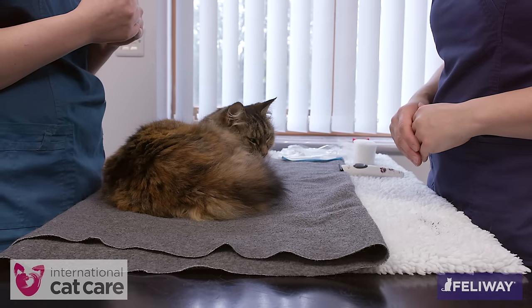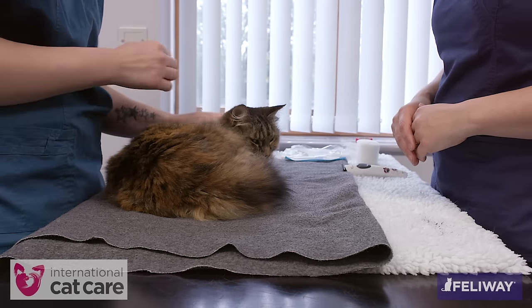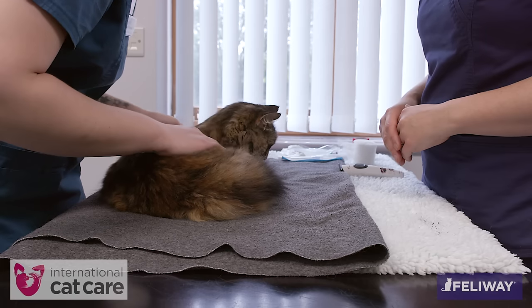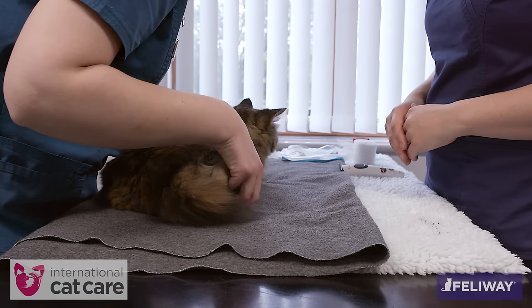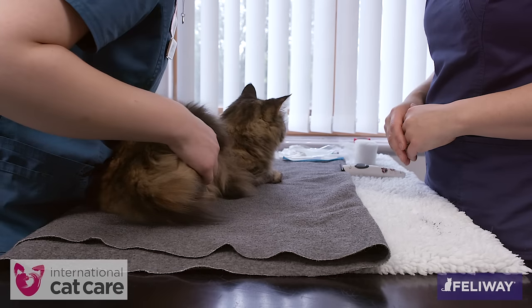To hold a cat that needs an intravenous catheter, the fundamental principles of cat-friendly handling should be applied. Place a towel on the table so it is warm and not slippery for the cat. Move slowly and calmly and reassure the cat by talking and stroking it. Before starting to restrain a cat for the catheter placement, ensure you have all equipment you need to avoid disturbing the cat by leaving the room.